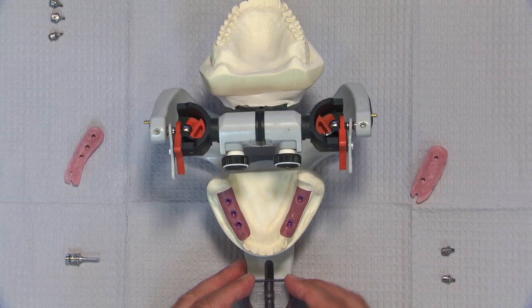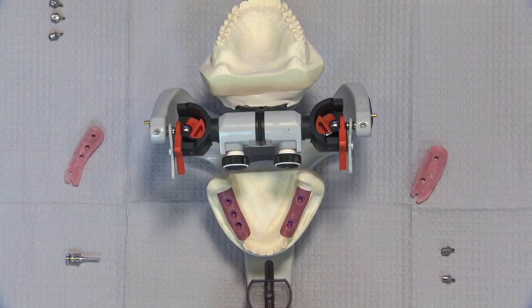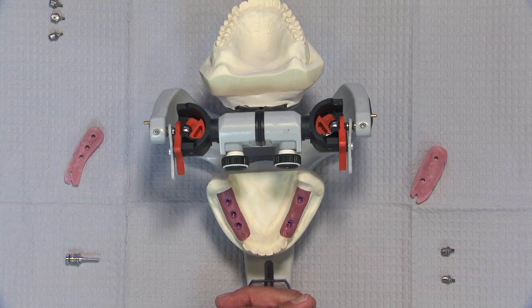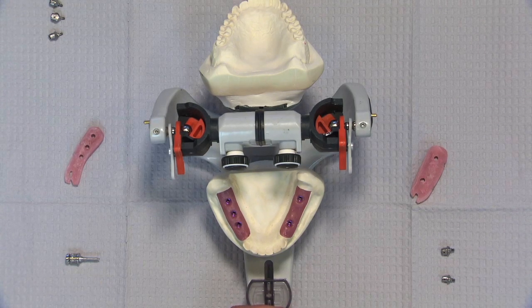So let's look at a patient who's had 5 implants placed here in a bilateral edentulous area. Now we're going to go ahead and take our impression. We're going to put the transfer copings into place, into the implants. Of course, you're going to want to take an x-ray, a digital x-ray hopefully, to verify that these copings have seated all the way onto the implant. Then we're going to take our implant level impression. We can do this with a closed tray method or an open tray. It really doesn't matter, but we want to make sure that the transfer coping is completely seated on the implant, and then we're going to take that impression and send the copings and the impression to the laboratory.